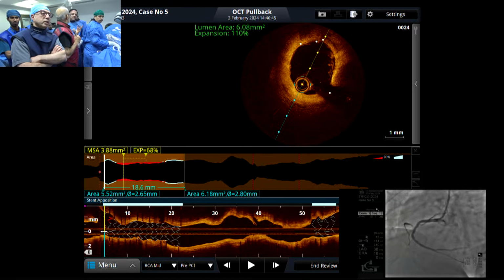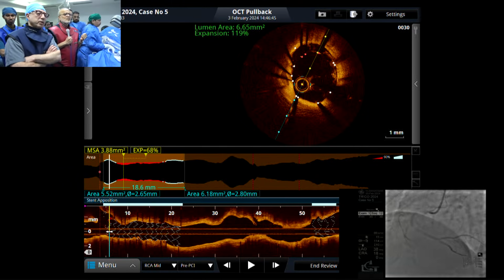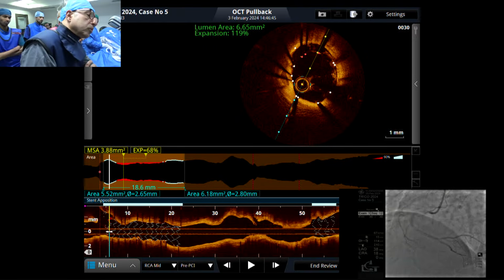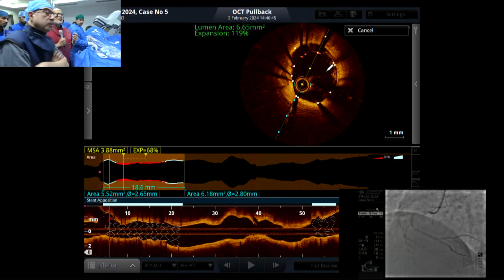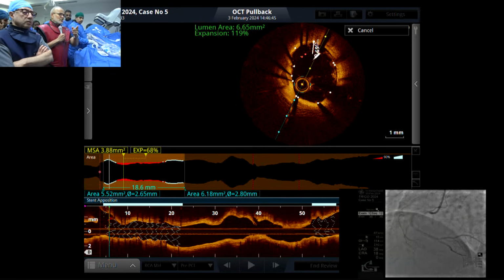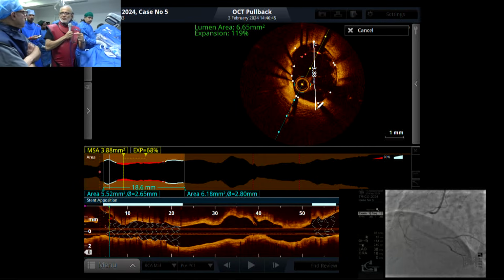It is 2.5, right there. What's the EEL diameter there? We can measure it, right? Can we just measure the length? I tell you why it looks so: there is a nodular calcium at 3 o'clock position, which is not allowing it to be circular.